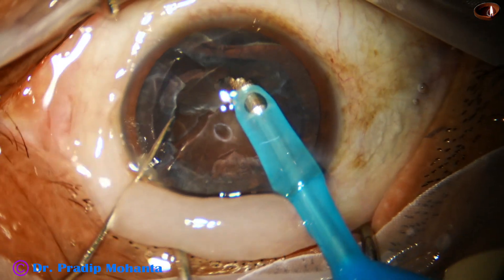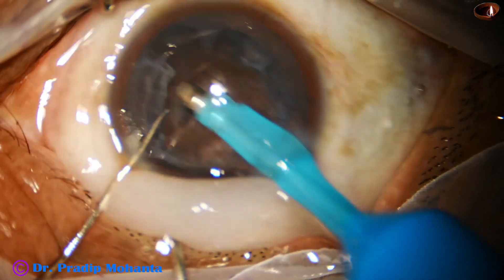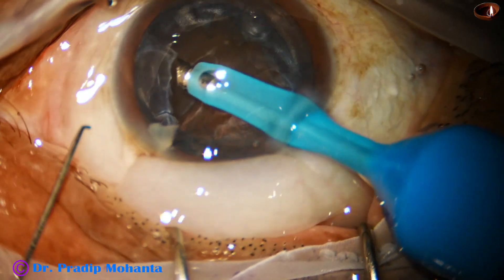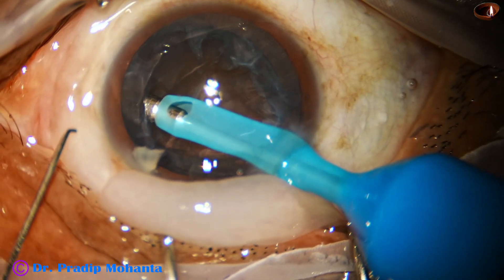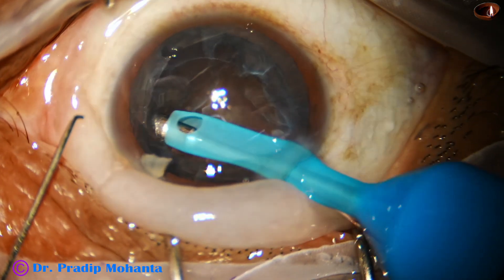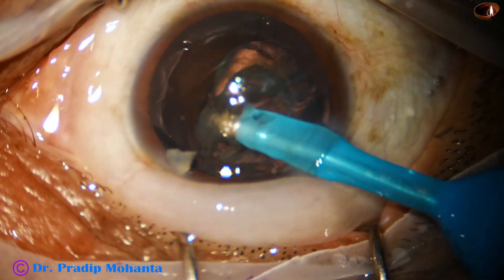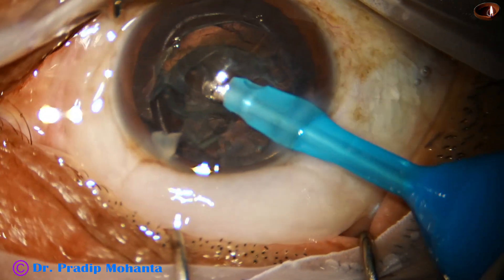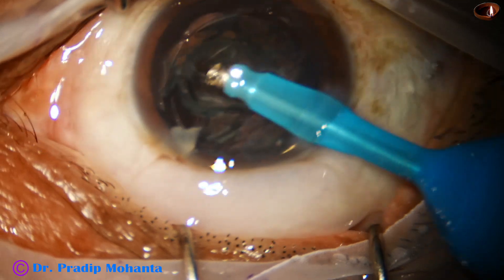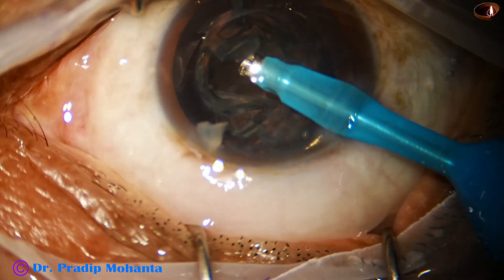So I instruct my assistant to increase the vacuum, and see how easily the epi-nucleus comes to the tip now.